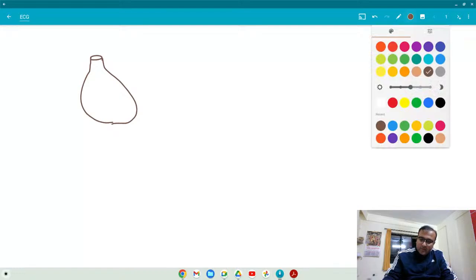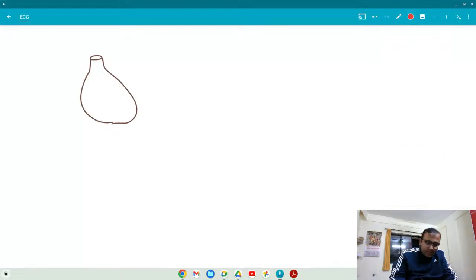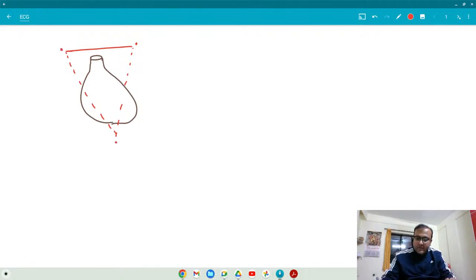So how have we got it? One was this way, one was this way, and one is this way. Then what else have we got? We have got AVL, AVR, and AVF. These are the two things that we have discussed.